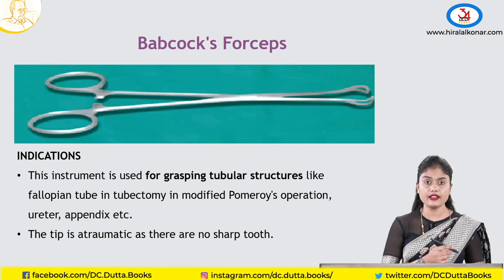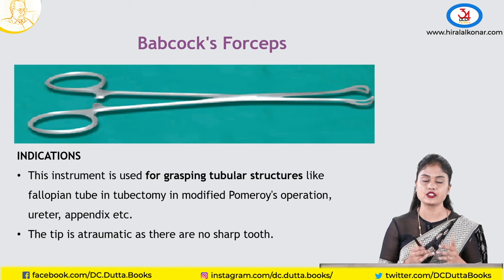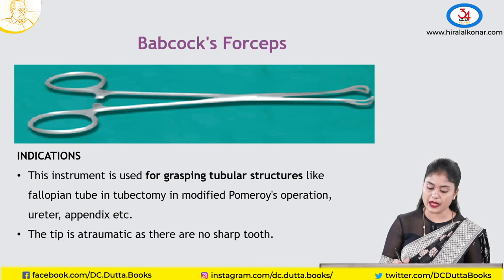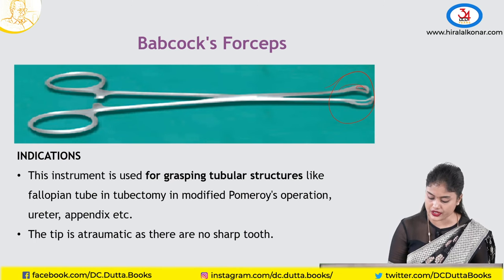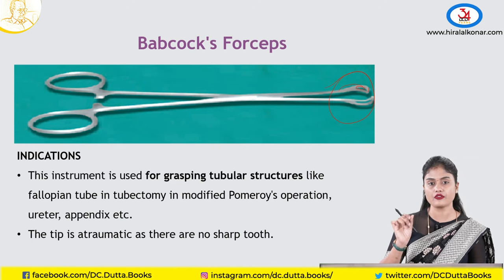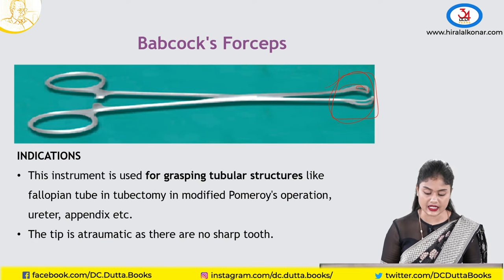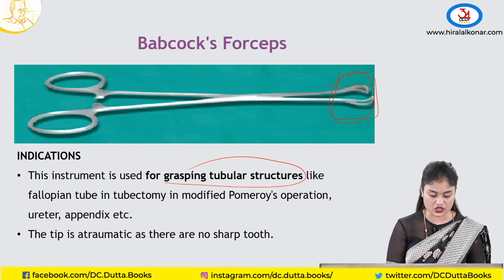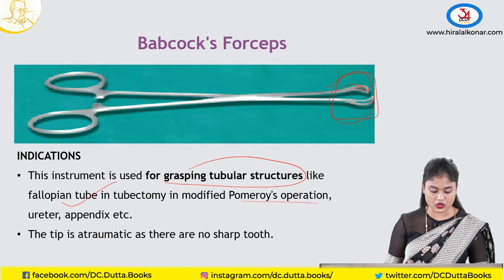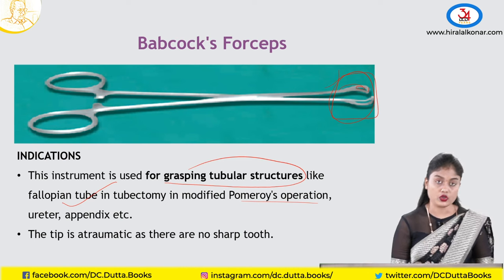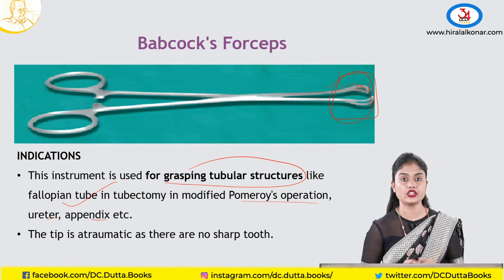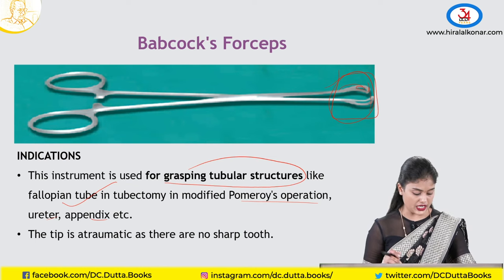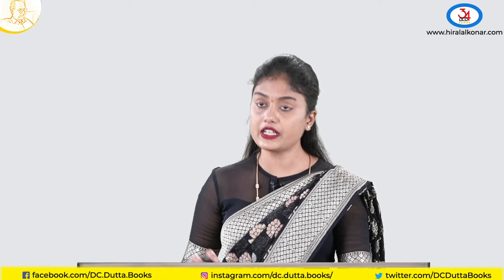Coming to Babcock's forceps. Unlike harsh instruments like valsellum, Alice, or Kocher's which have teeth, Babcock's has a bulge at the tip and serrations but no teeth — it is an atraumatic, soft tissue-holding instrument. We use it to grasp tubular structures like the fallopian tube in Pomeroy's method, or to hold the ureter, appendix, or intestine. The atraumatic tip does not injure soft and fragile tissues.